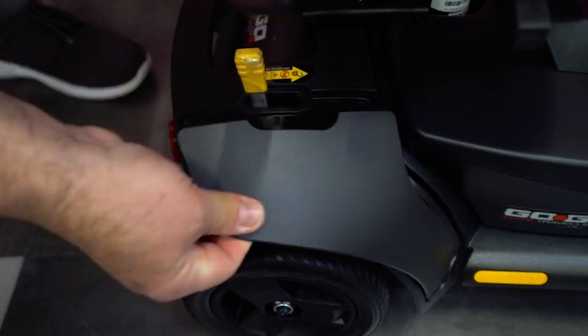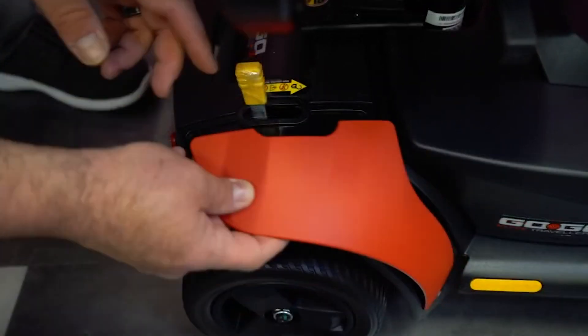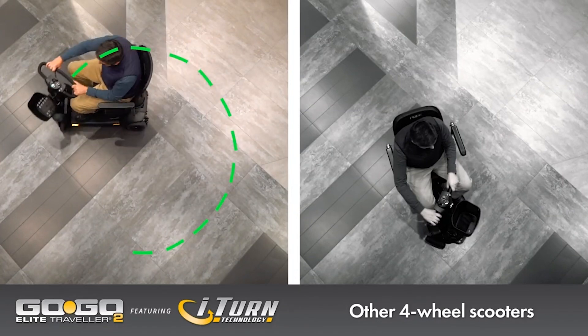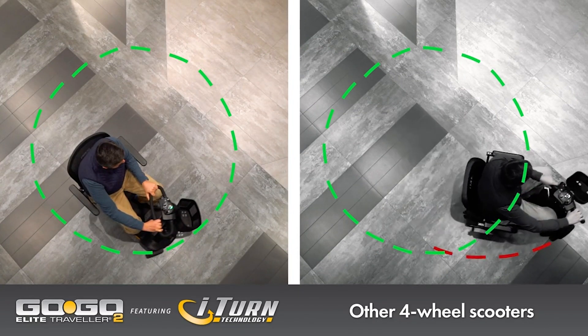The rear shrouds have a similar arrangement for easy removal and replacement. Enjoy your GoGo Elite Traveler 2 scooter and experience travel mobility like never before.